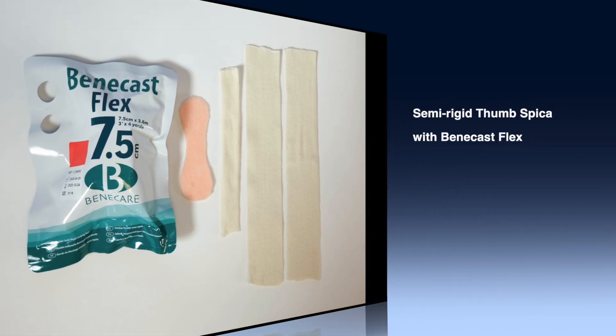Today I will demonstrate the application of a semi-rigid thumb spica using Benecast Flex.